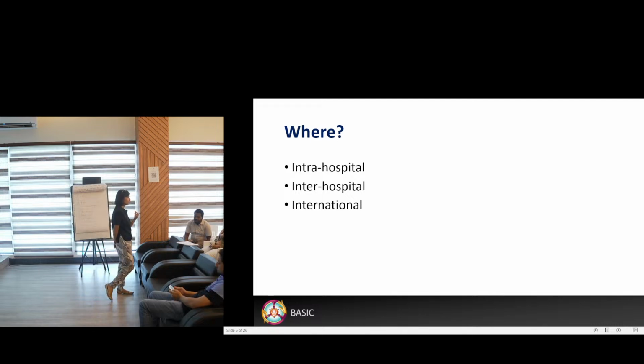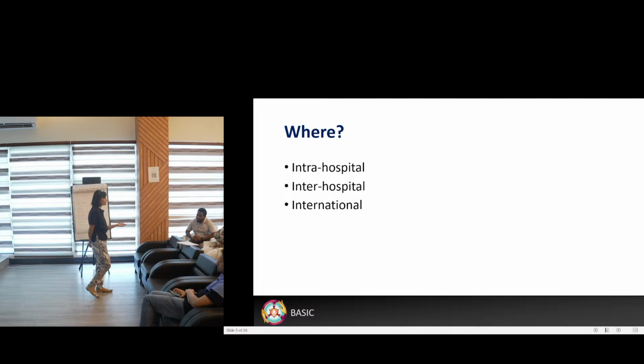How many of you take a defib when you go out of the hospital? Yeah. Could be on the defib monitor. Yeah, exactly. So some monitors on the defib have the ability to do full monitoring and have defib ability as well. So if you have one of those, you're better off taking that because it does both. Yeah? If you don't have one of those, then you have to take a separate defib, which is a bit of a pain. And so it comes down to a judgment call.